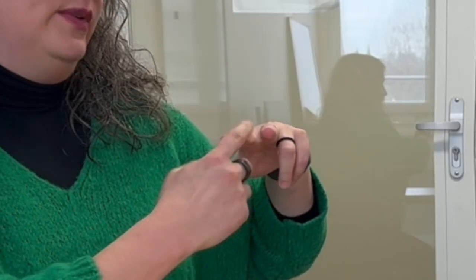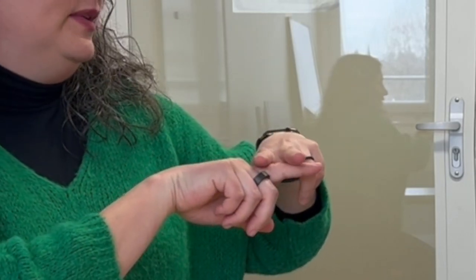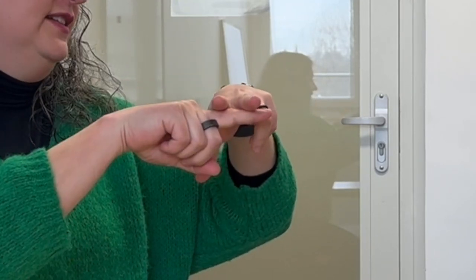So to me, I like to teach my learners that the ribs are the North Star to find the pleura. The ribs are the North Star in the sky, your guiding light, to find the pleura, because novices can see the fascia, the aponeurosis, and other things and think it's the pleura. Short axis ribs, bat sign, North Star to find the pleura.